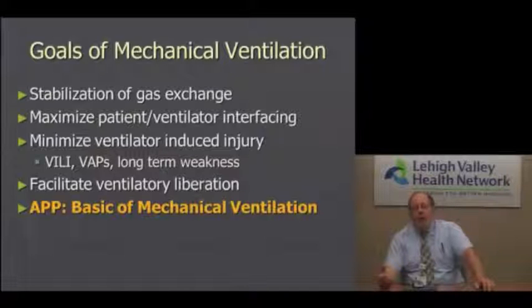we want to think about facilitating ventilatory liberation. Okay, a lot of the negative sequelae that can occur on mechanical ventilation can occur if the patient's not off the ventilator. So one of the things that we'll do immediately is, once we have stabilization of the gas exchange and the patient's clinical condition causing them to need mechanical ventilation has been stabilized or reversed, we think about, let's try to get patients off of the ventilator. Because ventilators do cost institutions lots of money, and they cause a lot of duress for the patient and for the patient's family.